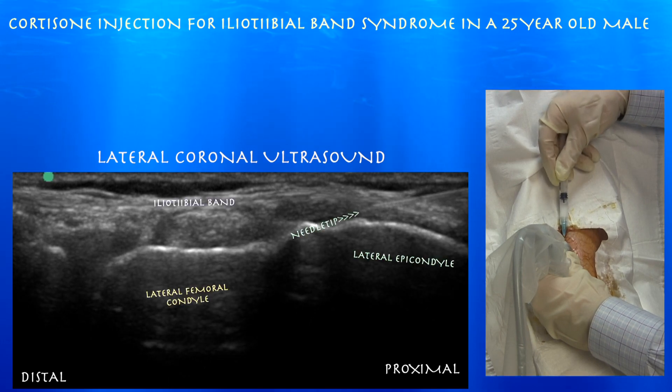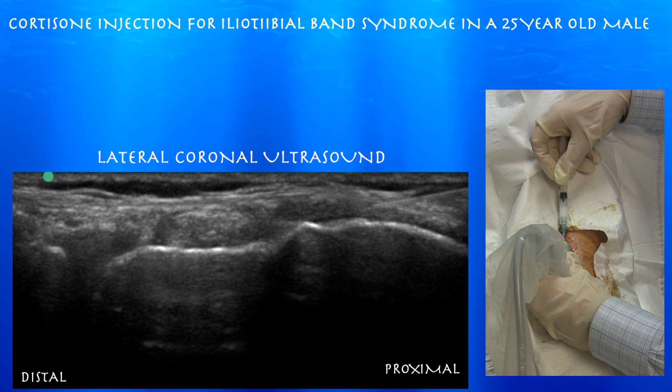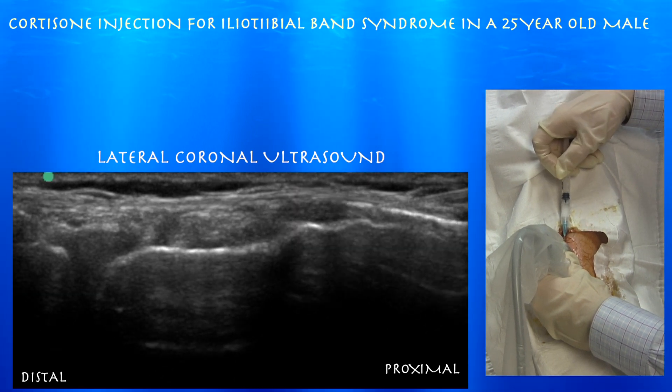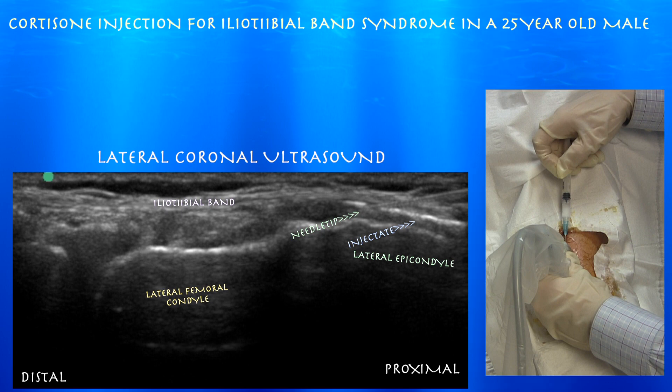Here we are starting the procedure. We're trying to get the needle just under the iliotibial band, between that and the lateral epicondyle — that's where we plan to inject the cortisone. You can see how that cortisone is spreading nicely underneath the iliotibial band.